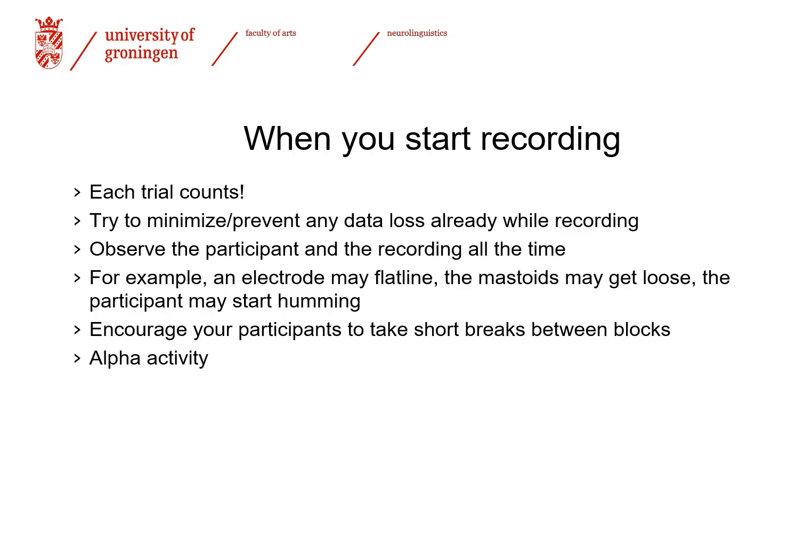And my final advice, when you've finally designed your experiment and programmed it, and now you're going to start recording: each trial counts. Try to minimize, prevent any data loss while recording. Observe your participants and the recording all the time. Don't leave the room while the recording is ongoing.